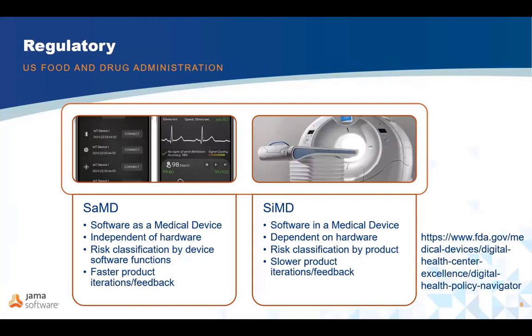The FDA has indicated that they intend to target their oversight over software that is an extension of one or more medical devices, software that transforms a mobile platform into a medical device by using attachments, displays, sensors, or including functions like a regulated medical device, software that performs patient-specific analysis and provides specific outputs or directives used in the diagnosis, treatment, mitigation, cure, or prevention of a disease or condition.